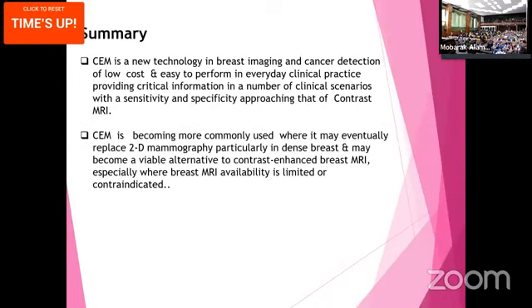In conclusion, contrast enhanced mammography is an emerging, promising new modality that is used for breast imaging and cancer detection. Of low cost and easy to perform in everyday clinic, providing critical information in different clinical scenarios.